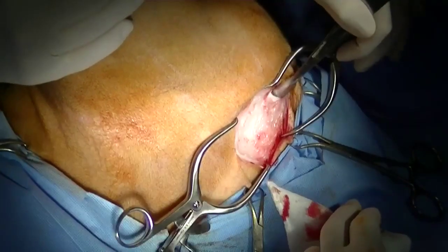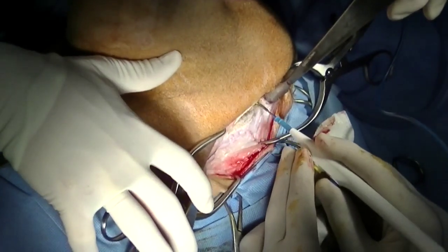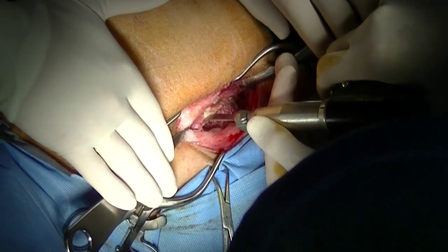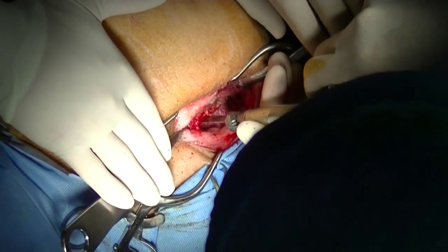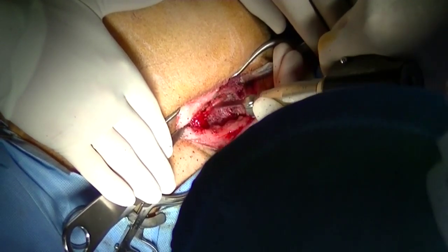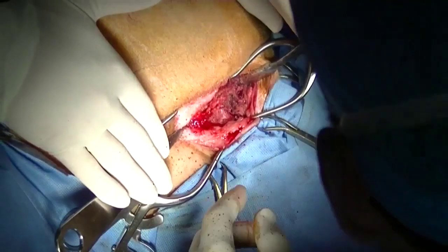It's critical that when this cut is being made, the urethra is protected. I have seen dogs have urethral damage during this part of the procedure. Once the pubic cut is made, it's important to make sure that the pubic symphysis is completely divided and that the two sides can move separately from each other.